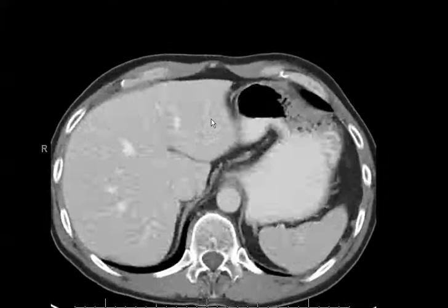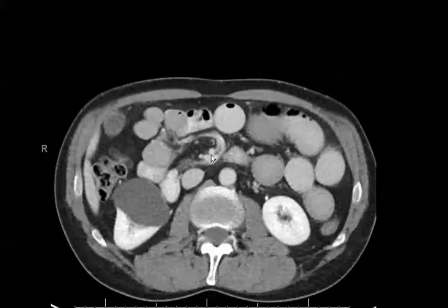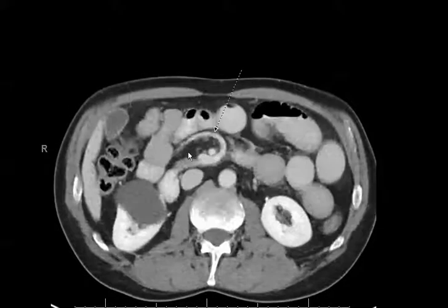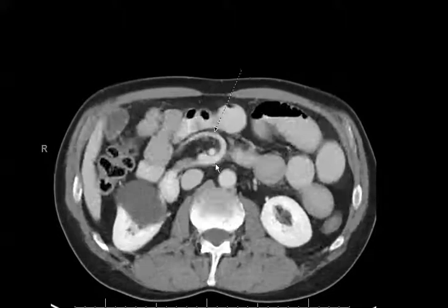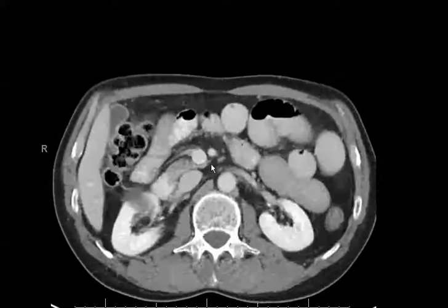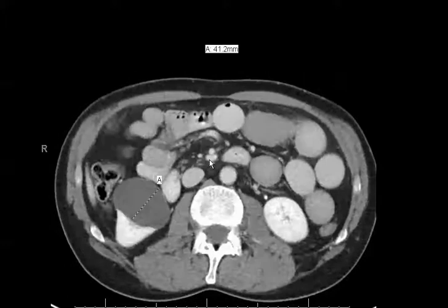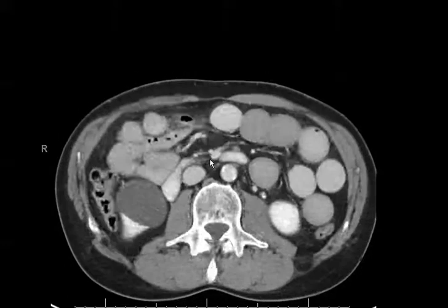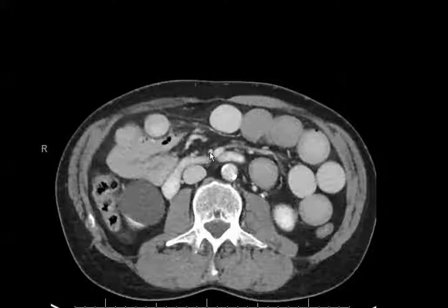When scrolling through these images, notice already that we have bowel loops that are swirling around the superior mesenteric vessels. Notice also that the superior mesenteric artery should be on the left side of the superior mesenteric vein. As we go down, this relationship reverses and the superior mesenteric vein now becomes to the left of the superior mesenteric artery.